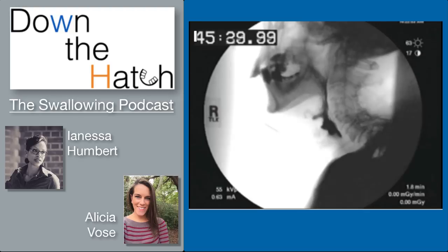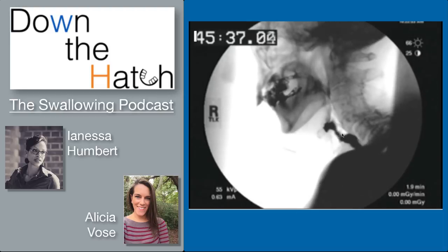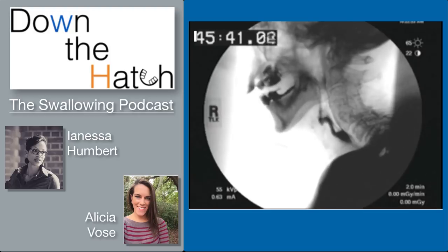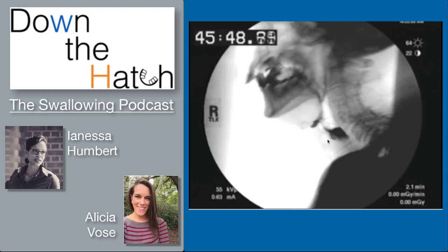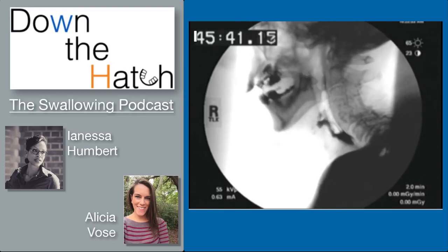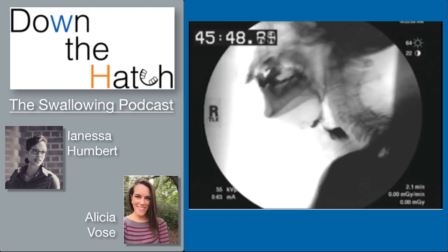One thing I'm not seeing is a lot of pharyngeal constriction, based on the stripping wave we would see in this region — that's probably helping to keep the bolus in the pharynx. As mentioned, upper esophageal sphincter opening seems short in duration, so needing multiple swallows gives the bolus a chance to penetrate the airway. Interestingly, because this was a thick bolus, the person did not end up aspirating and seemed to have pretty good ability to eject the bolus each time it entered.